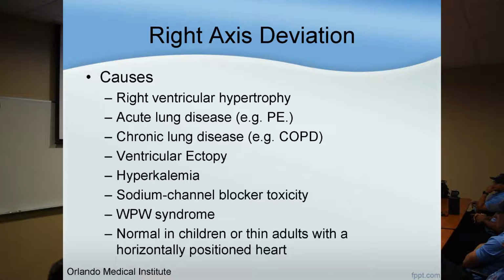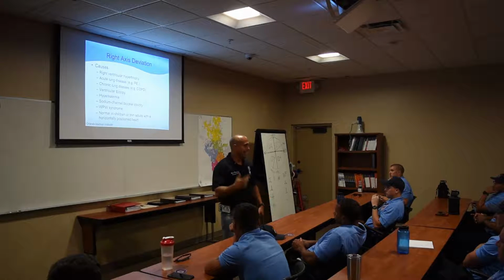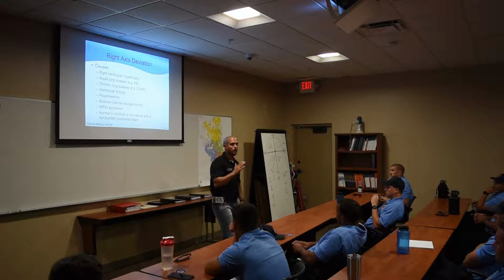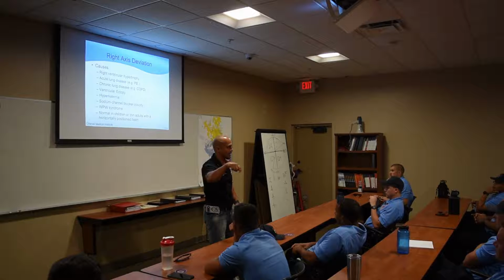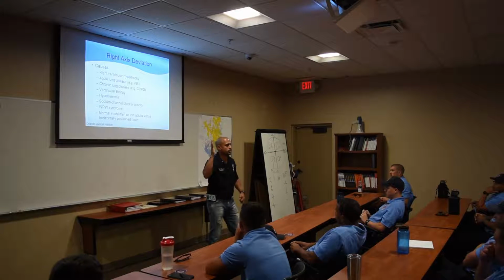You guys use LifePak 12s? You know what it asks you for every time you hit 12 lead? What's the first thing it asks you for? Age. And why do you want to know the age? Because under the age of 15, it changes your hertz. Do a 12 lead under 15, do a 12 lead over 15. Under 15 is going to push your hertz to 150 hertz.